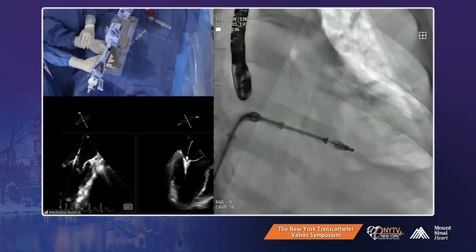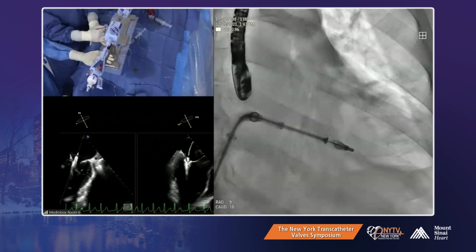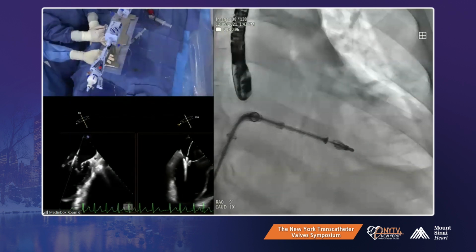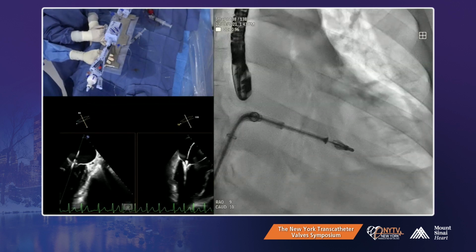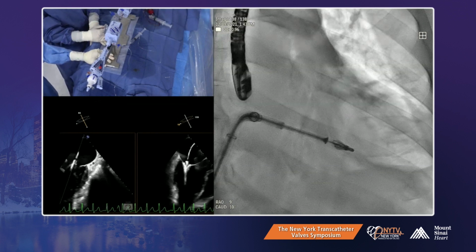Howie, you're worried, right? You worry about the leaflet length on the posterior? As you know, with the XT device, you need at least 8 or 9 millimeters in, or you don't have grasp. The grasping action is at the base of the clip, not at the tip of the clip. So what do we have for leaflet length insertion? 11. So the imagers, Stan and Malcolm, said we have 11 in roughly on the calculation. Good.